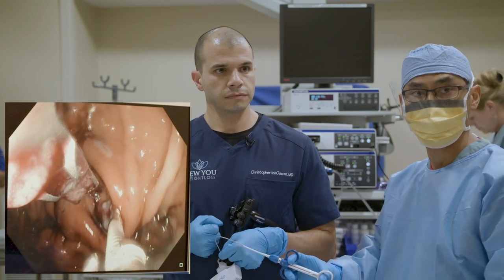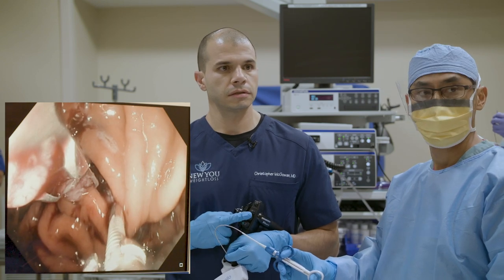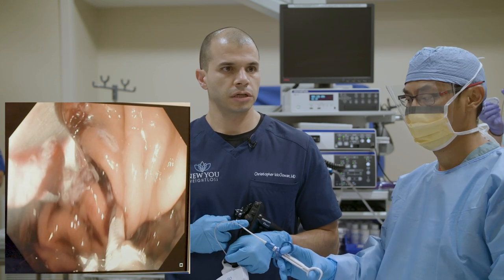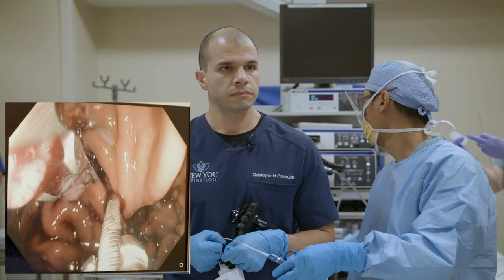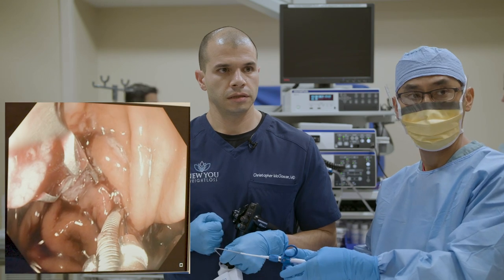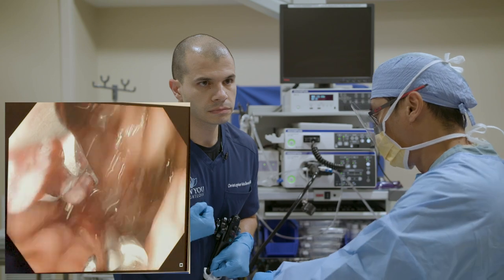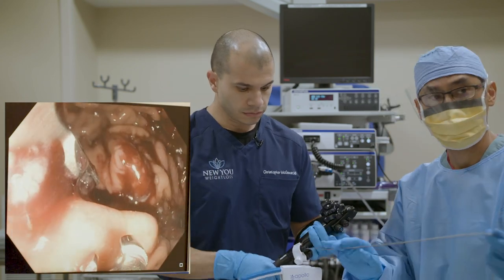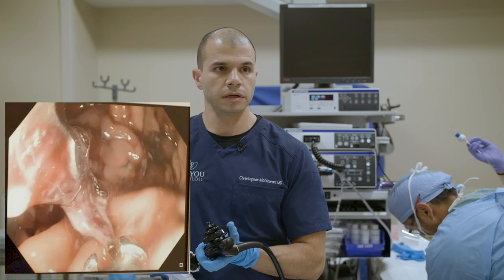We're cinching this one — I'm pulling that suture in and you can see it coming together. Let's cinch right there. We have two down and we're working our way up the stomach. We're going to clean up a little bit and take a look at what we've done.